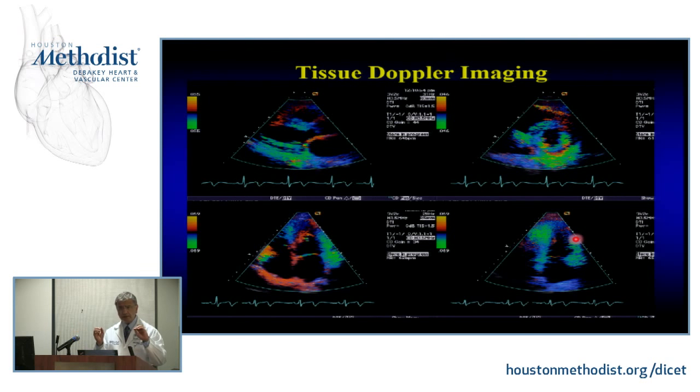However, we suppressed this for many, many years. Actually, we rediscovered it 15 years ago or so. Okay? I would say 20 years ago. Time is flying quickly. And the reason we suppressed it was because it was more noise than anything else. Just imagine, you're looking at the ventricle and you're looking at flow and everything else. And the interesting thing is you can suppress it or turn it on because the characteristics are very different.